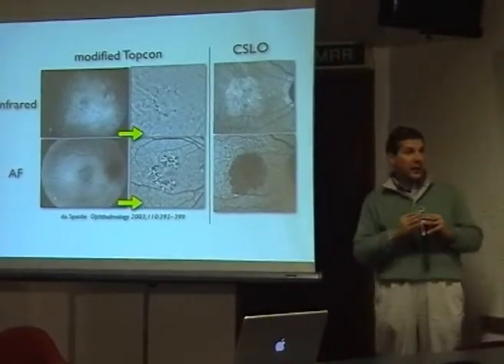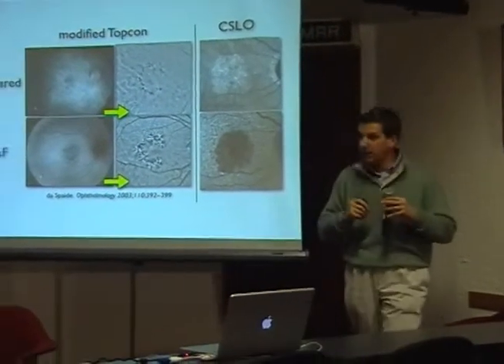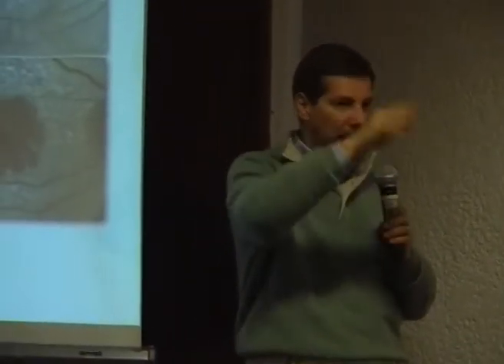this filter has leakage. Do you know what leakage means in filters? I try to explain. If you have a barrier filter that allows some light to come in and out, and the excitation filter, if they are not overlapping, are fine. If they are overlapping, this is a leakage.